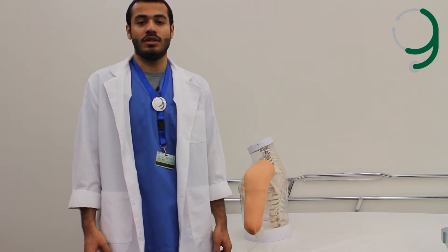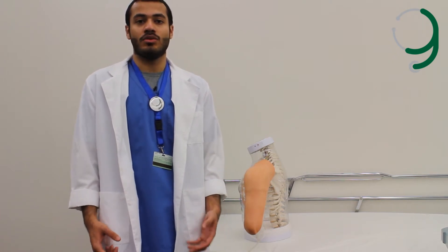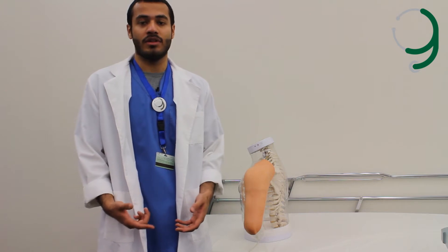This video tutorial is to show you how to use the intramuscular and subcutaneous injections and to illustrate the techniques used with both methods.